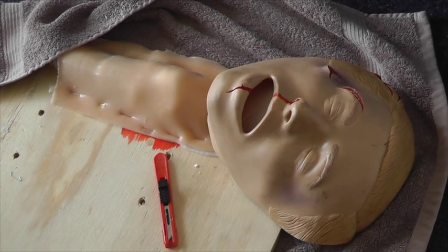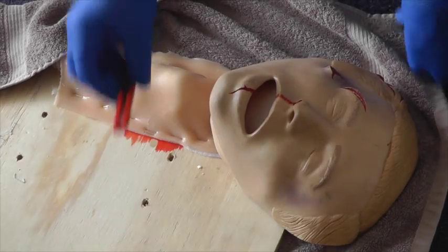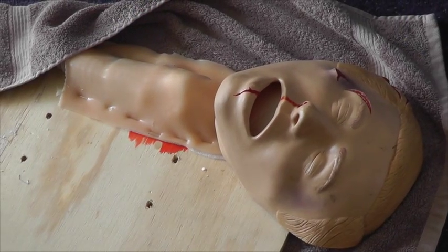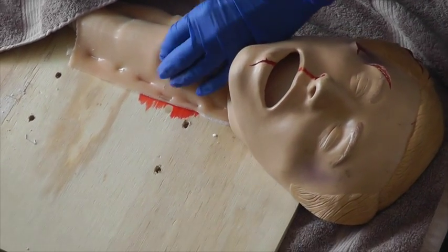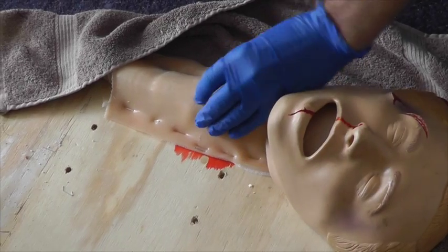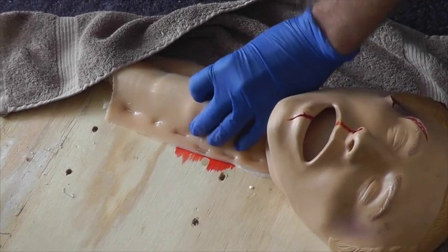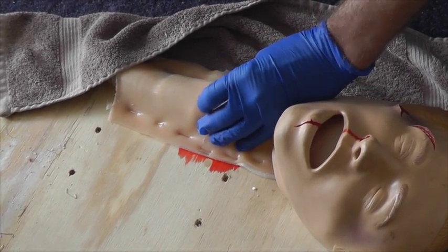All right, Clare, we've got can't intubate, can't oxygenate. We're going to go for a surgical airway as planned, ready with the equipment. Head is extended on the neck, laryngeal handshake — identify the cricothyroid membrane.